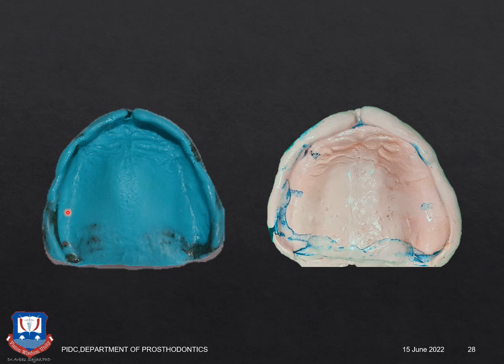So this is how a final impression will look with the zinc oxide eugenol, and on the left we have a final impression which is taken with a medium body silicone impression material.